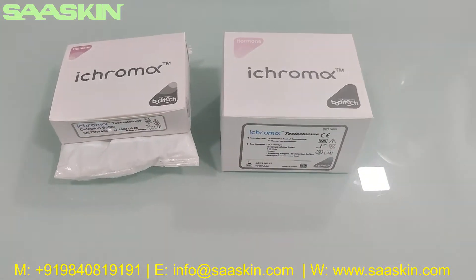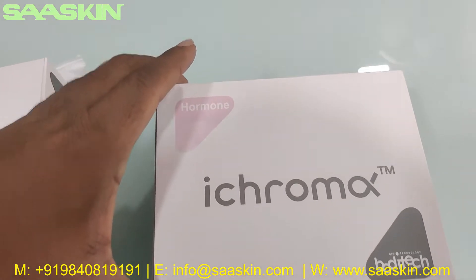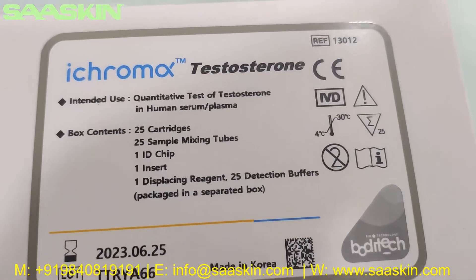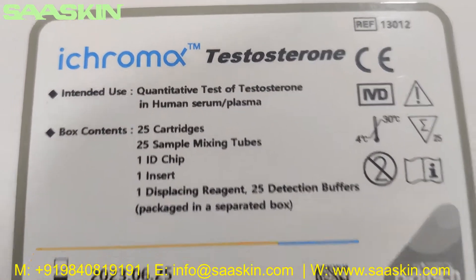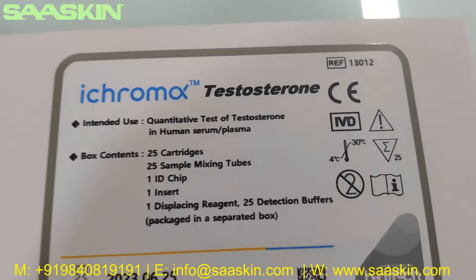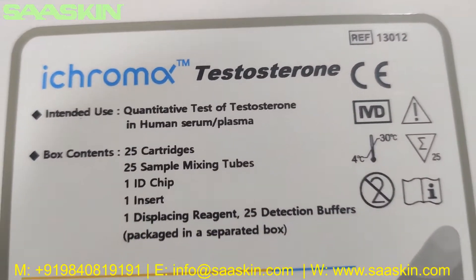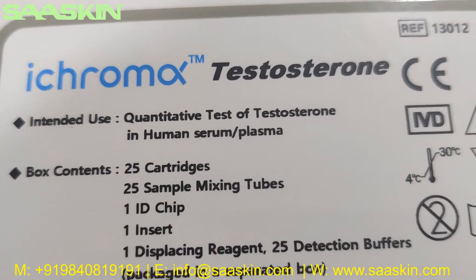Hello everybody, today we're going to see the unboxing of a product from Bodhi Tech for hormone analysis — the i-chroma Testosterone. You can see that this is the test cartridge pack for the i-chroma Testosterone 25 test kit pack. It is a CE IVD certified product, used for the quantitative test of testosterone in human serum and plasma.